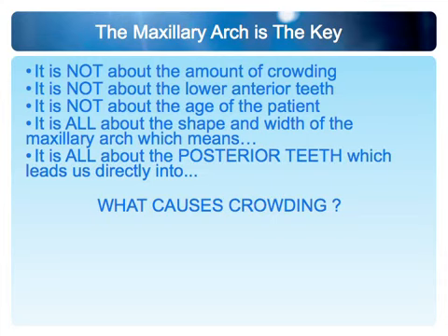And the more we stare at the lower front teeth and their crowding, the more difficult it's going to be to treat the case. It's really not about the amount of crowding in the mouth, okay? I never measure what the crowding is. I will not look at overlap and say, there is 2 millimeters here and 1 millimeter and a half there, and come up with a number of 6 or 7 or 8 or 10 millimeters of crowding. I'm really not interested in the amount of crowding in the mouth.